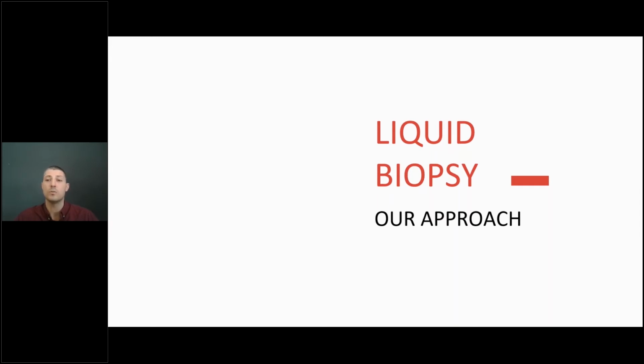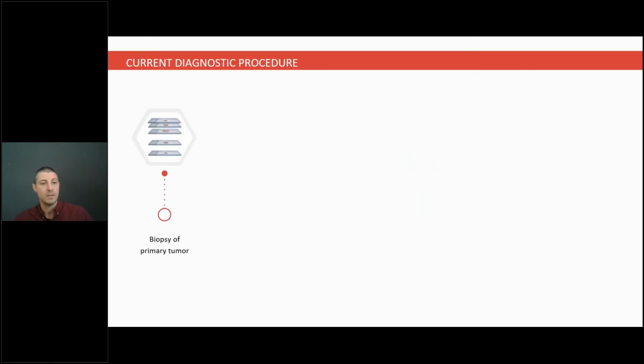Now I would like to present our approach, how we want to use liquid biopsy in our clinic. So this is an overview of a typical current diagnostic procedure in our clinic. If we have tumor material available, then we send this for tumor sequencing to Foundation Medicine. And this is a very comprehensive sequencing test of the tumor biopsy.